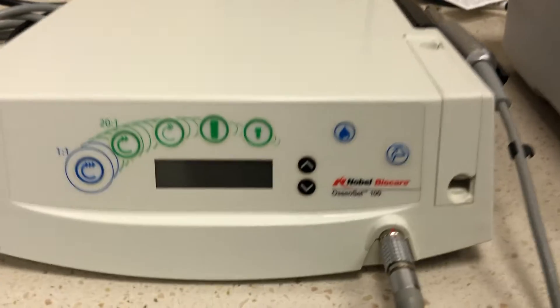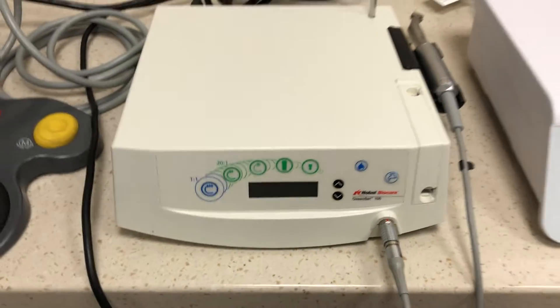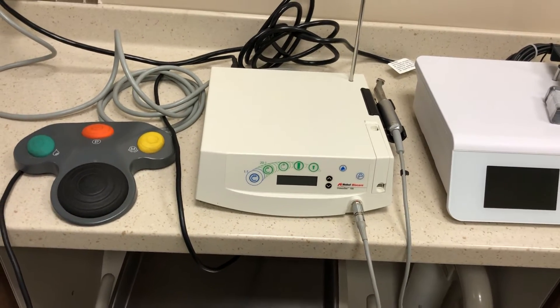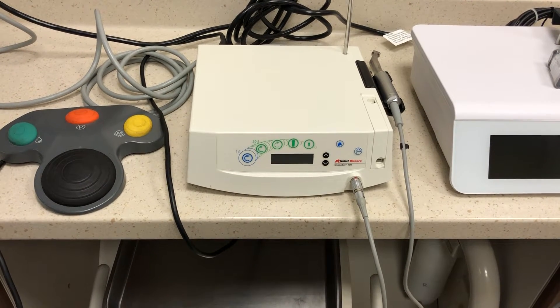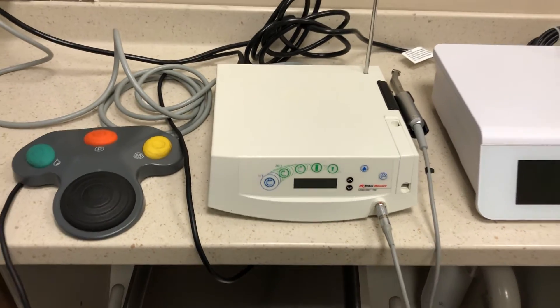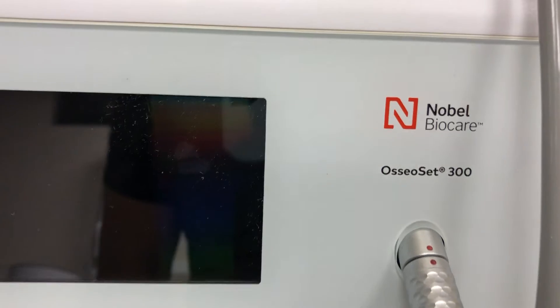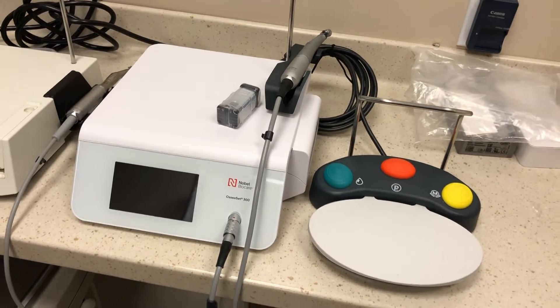This is the Osseoset 100. It's labeled Nobel, but it happens to be made by W&H — just Nobel branded. This is the first implant motor that I had. It's probably about 15 years old, maybe longer than that, and it's been working well ever since. As a bonus, I received an Osseoset 300 and just unpacked it. You can see all the packaging here, and I decided to plug it in — it's definitely much more advanced than I thought.